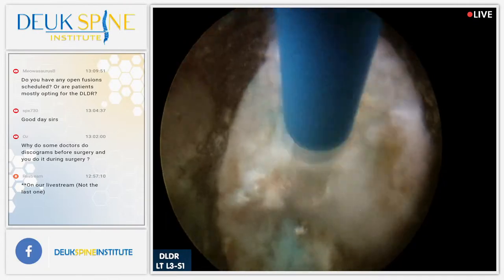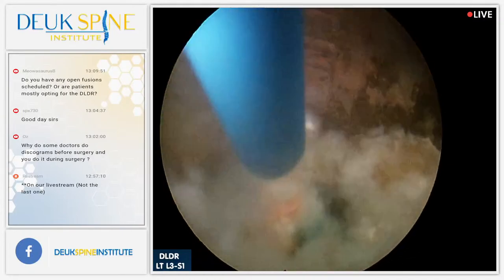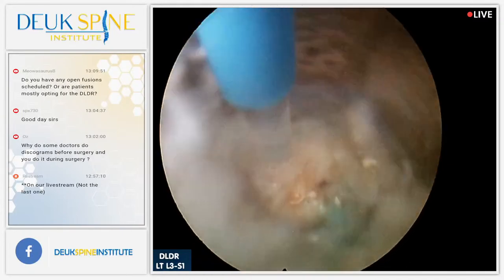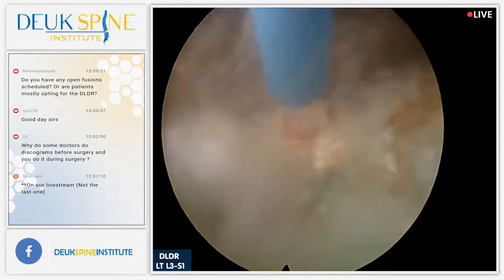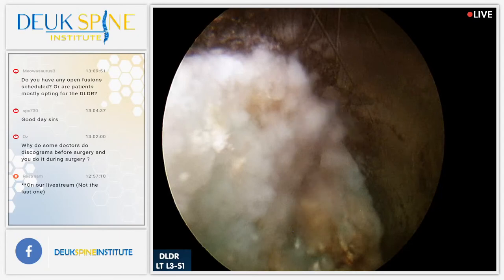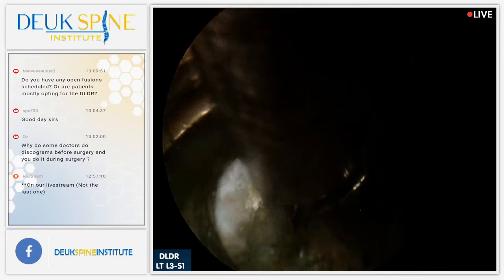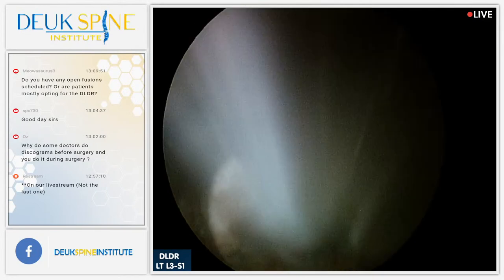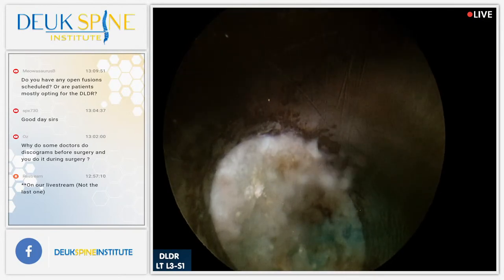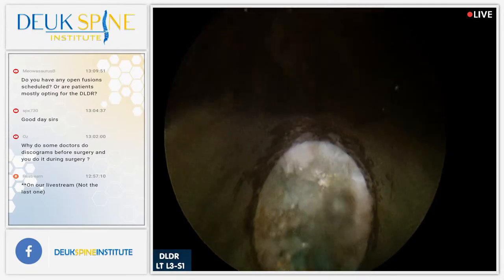Might as well record the patient's response while we do it, so we have that data. So there you go. In other words, we don't do the discogram because we're not sure of the pain source. We're doing the discogram for a therapeutic effect. We're actually using what we inject to make a diagnosis and to provide treatment, which is the surgery you're watching. But since we're doing it, we might as well just record the patient's response.